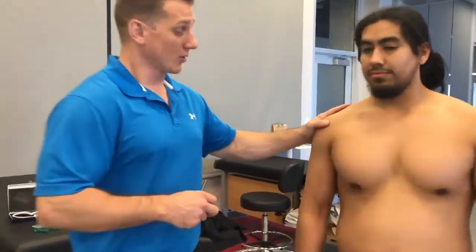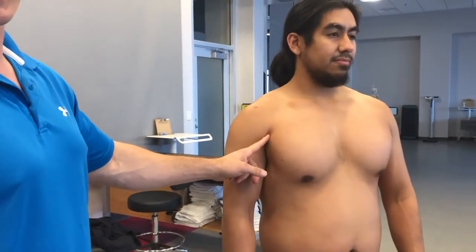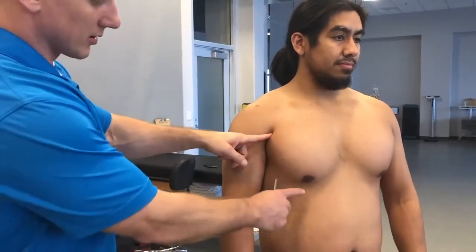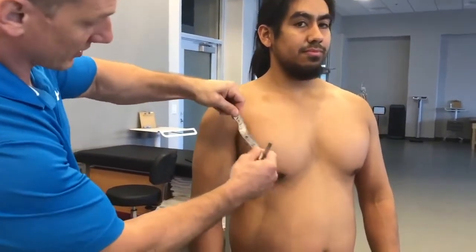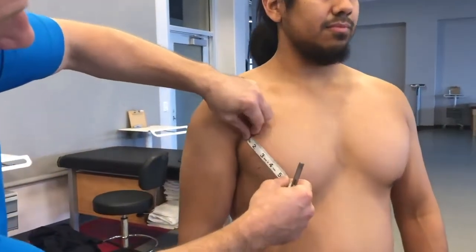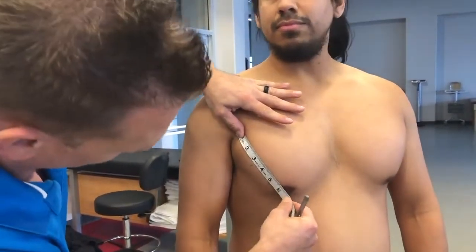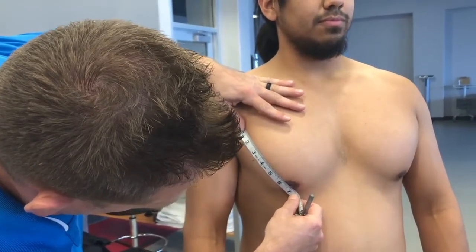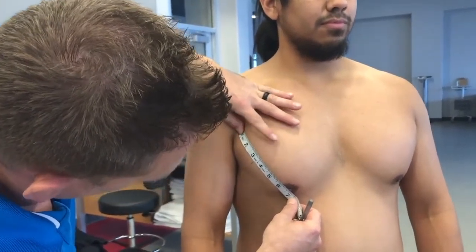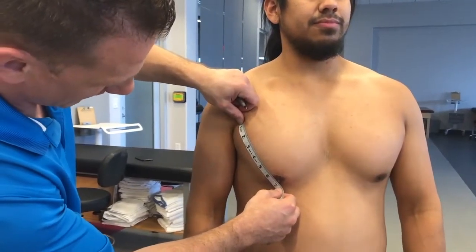The first site we're going to address is the pectoral. I'm going to take a measurement from the anterior aspect of his axillary to the nipple line. I'll take my tape, pull it taut, put the end at the anterior axillary, and pull it all the way across his nipple line. The measurement we get is six and three quarter inches, and we'll want to take the midpoint from there.